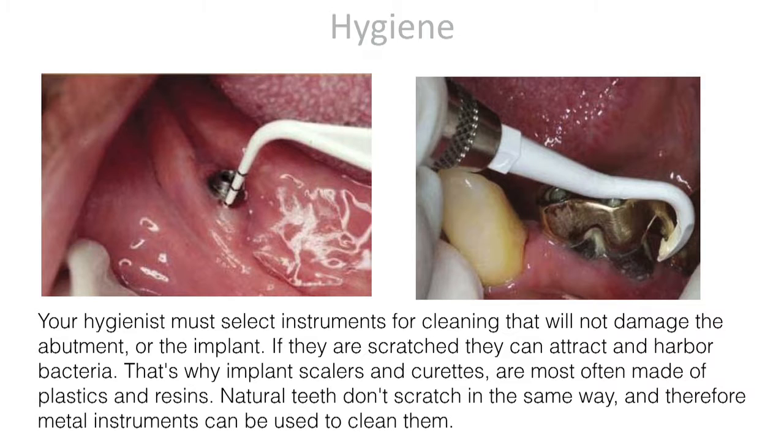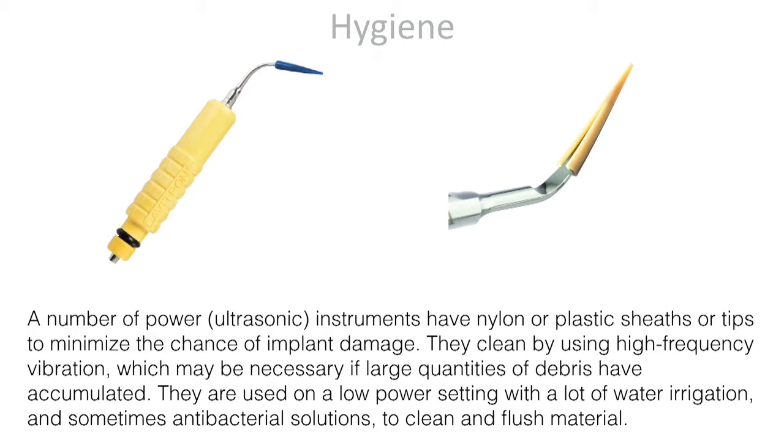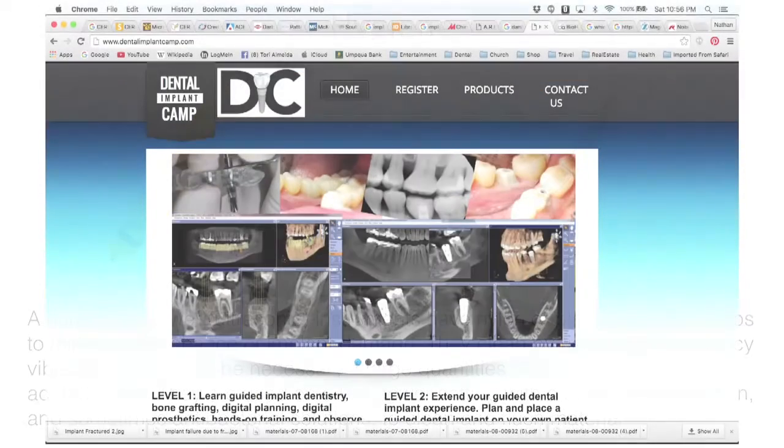Other things you might look at is the hygiene. Selecting instruments that aren't metal, because metal on metal, it's going to scrape that implant material and cause problems over time. And so you want to keep it with softer materials. Where a tooth would respond well to metal scrape, it heals well, it all changes the surface. When you do it with metal, it becomes an opportunity for bacteria to congregate. So use material that's synthetic rather than metal. Even ultrasonics have nylon or plastic sheaths that can go on top of the ultrasonics to keep them from scratching the abutments or the implants. So make sure you keep that in mind when you're having your hygienist maintaining the health of the tissue around the implants. All right, and that's it for us.